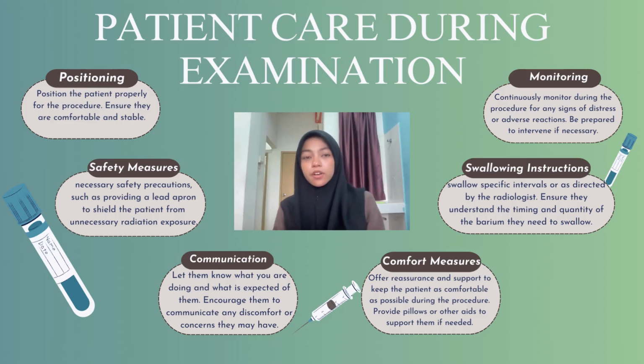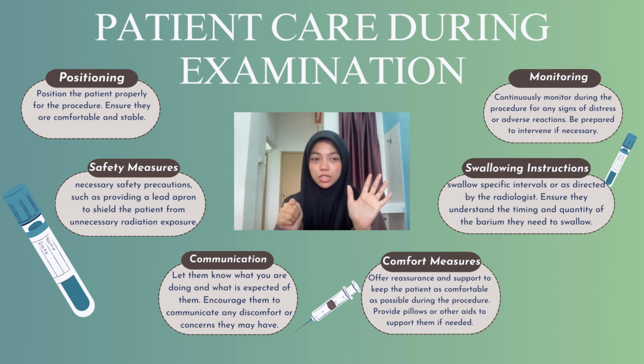Now, one of the most important parts for us as healthcare providers is patient care during the examination. I'll provide 6 for today's. Okay, we start off with positioning. Position the patient to ensure they are comfortable and stable. Swallowing instruction: ensure they understand the timing and the quantity of the barium they need to swallow. Monitoring: continuous monitoring during the procedure for any sign of distress or adverse reaction. Be prepared to intervene if necessary.